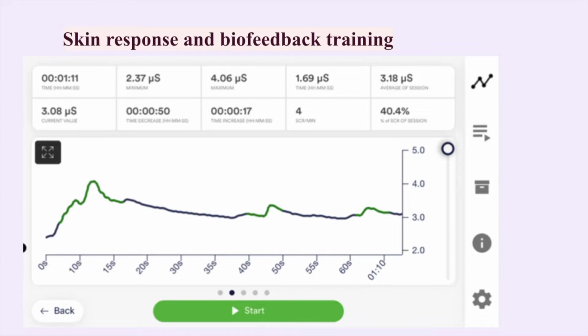A biofeedback training consists of 4 training stages. Schedule for the first training about 60 to 90 minutes of free time in which you can conduct the training undisturbed and flexibly. We're just going to be using this to get data for various types of distress.